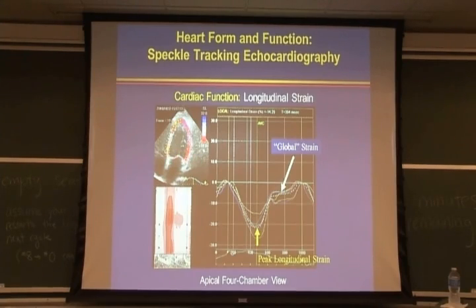In this view, we can apply 2 other different views, meaning a total of 18 segments we can measure, and we can measure their global strain as well as the individual strain of each segment. So we can measure the strain in 18 segments individually, or we can measure the aggregate effect of the total segments in the form of global strain.